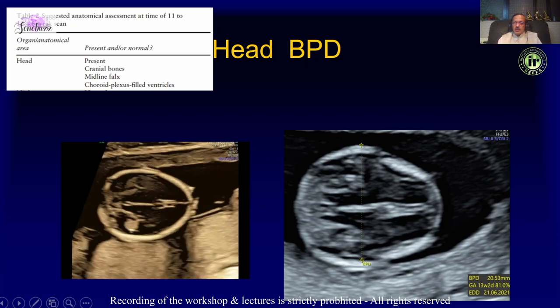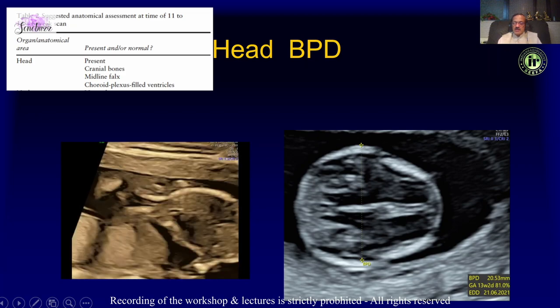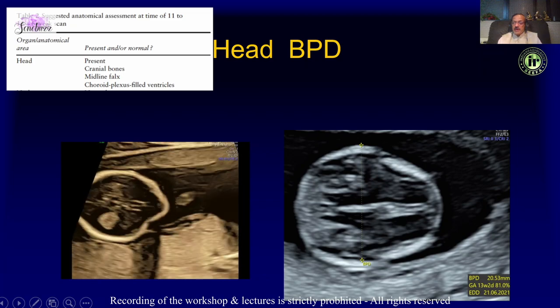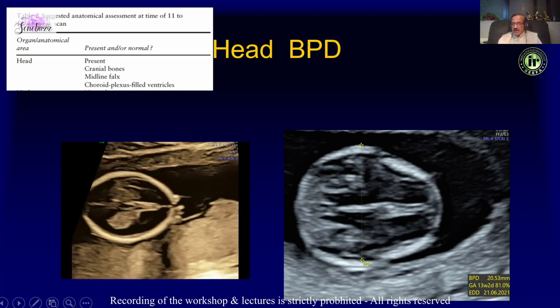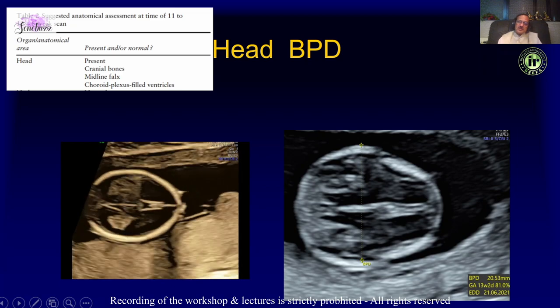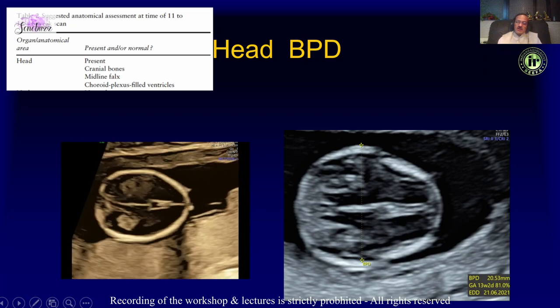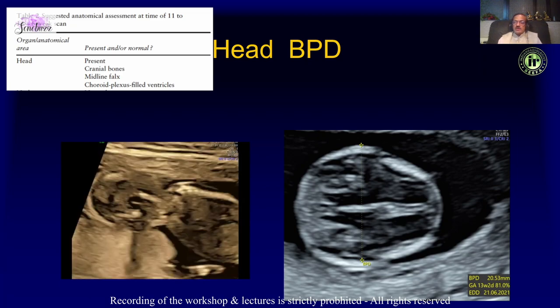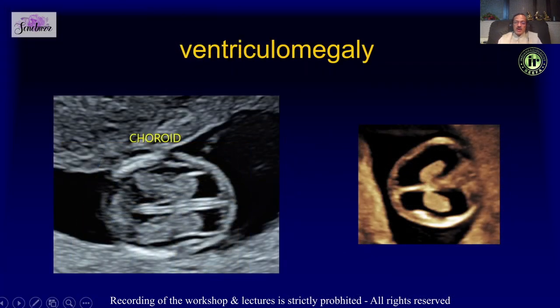It is also a good idea to measure the biparietal diameter, because a small BPD can be a clue toward the diagnosis of spina bifida. Make sure that the choroid plexus fills up the ventricle — this is very important because now you can pick up ventriculomegaly in the first trimester.